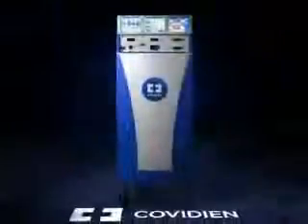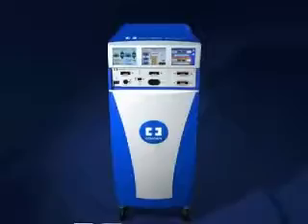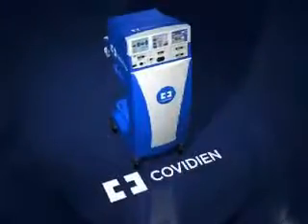Welcome to the Getting Started video for the Valleylab Exchange Software Update System. The following presentation will provide information for installing Valleylab Exchange Software Update System on the web-connected computer in your clinical engineering area, followed by performing a Force Triad software update.